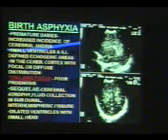This is the birth asphyxia. Due to brain edema, pressure obliteration of the ventricles takes place. Due to sudden swelling of the brain, there is pressure obliteration of the ventricles. Highly echogenic distribution is seen around the parietes, here in the parietal lobe. We can see obliteration of the cavum septum pellucidum and the ventricles due to the brain edema. So all these things we usually see on ultrasound, and we can immediately say this is birth asphyxia.